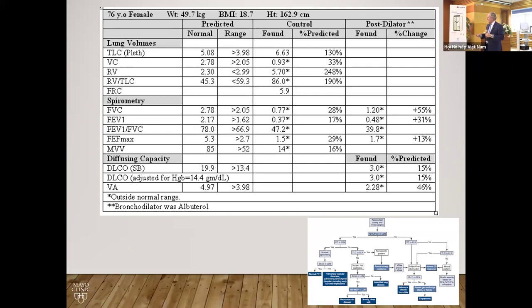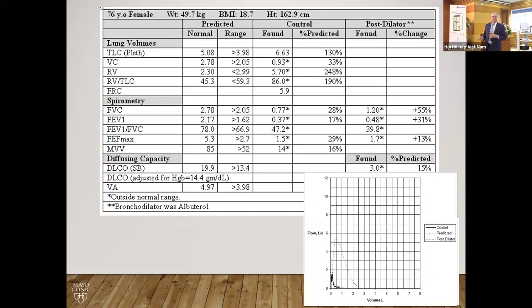So in this particular case, the very first thing we're going to look at is not the ratio, but the graph itself. So through those 4 points, regardless of how small or large the data is, does it hug the y-axis? Does it go straight up and down? Does it have a peak? Does it go to baseline without cough or artifact? And does it reach baseline? In this case, that would be true. So the quality of the test, even though we're only seeing one maneuver, looks good.